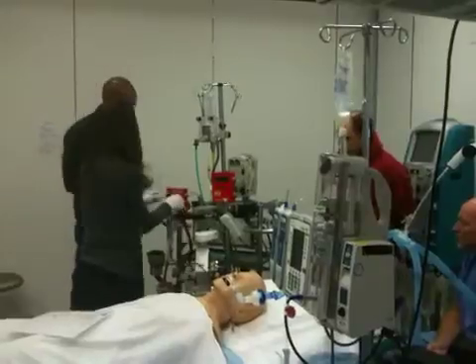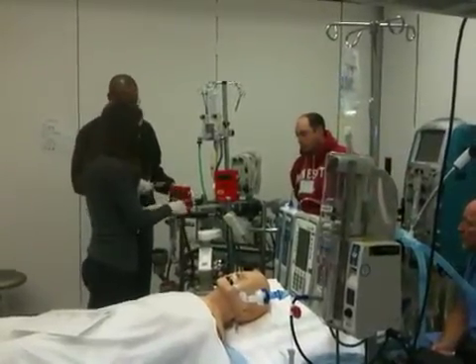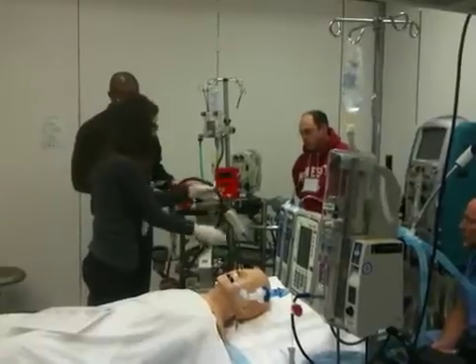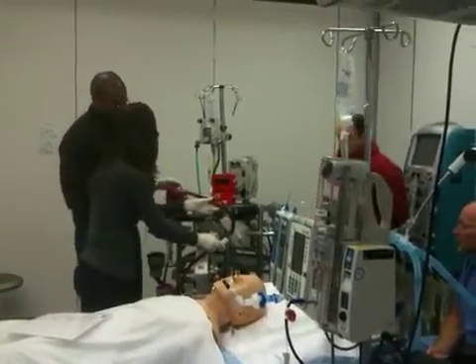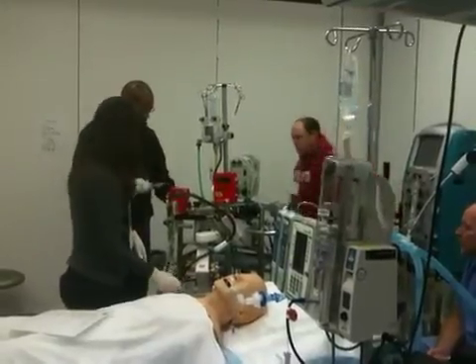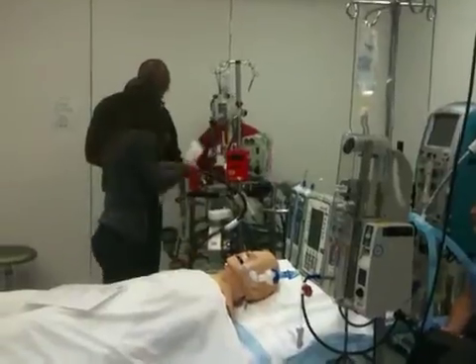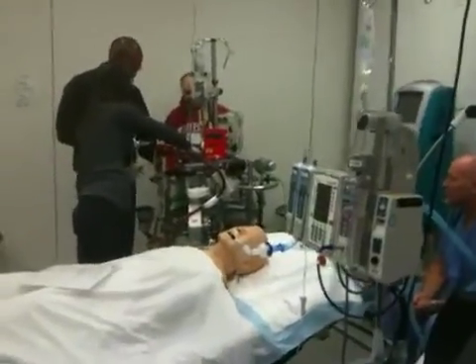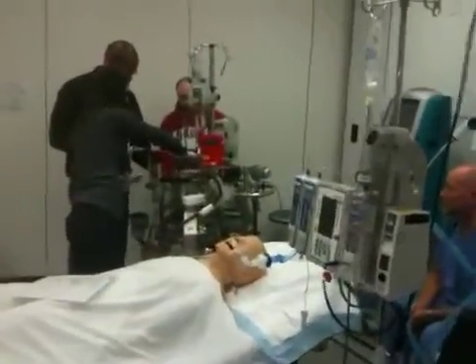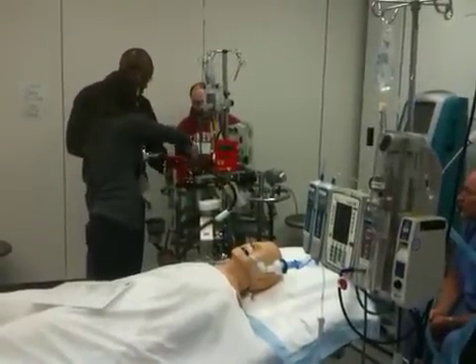Let's go back on. That should be a small enough. Okay. Start turning up your flows. Make sure this is good. Should be able to just start turning this. Hold on, it's giving me an error message. Okay. Did you turn it off? Let's turn it off.